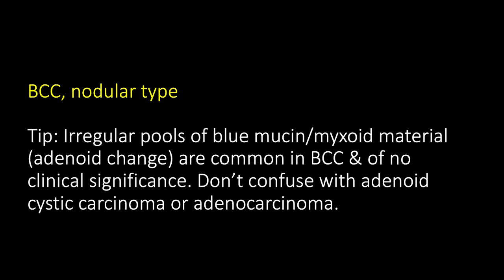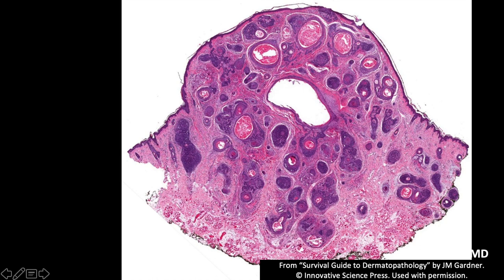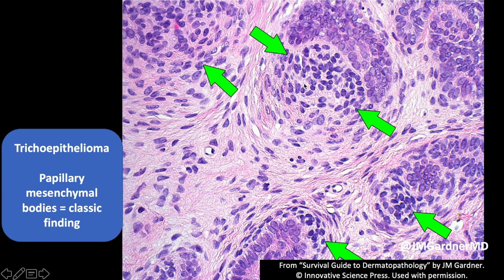This next case looks kind of like a BCC from low power and has some cystic spaces filled with keratin, but looking closer there's a funny cellular stroma with rounded to oval stromal cells — keratin-negative, so not epithelial. These rounded stromal cells are pushing into the basaloid nest — that's a papillary mesenchymal body, recapitulating the hair papilla that bulges into the germinative cells of a normal hair follicle. This is a trichoepithelioma, a benign hair follicle tumor. If you see papillary mesenchymal bodies, think trichoepithelioma, not BCC — particularly in younger patients without much sun damage.